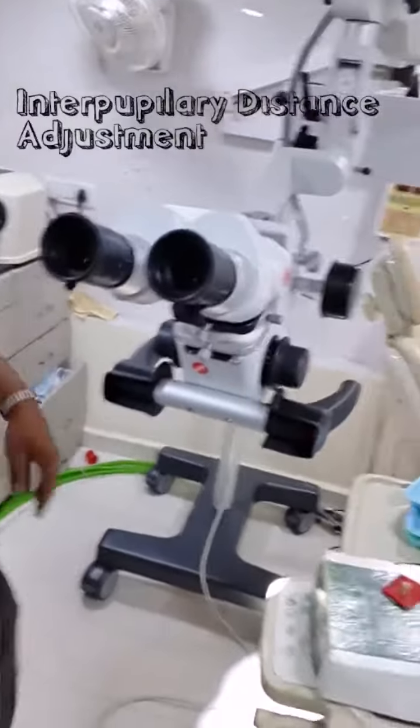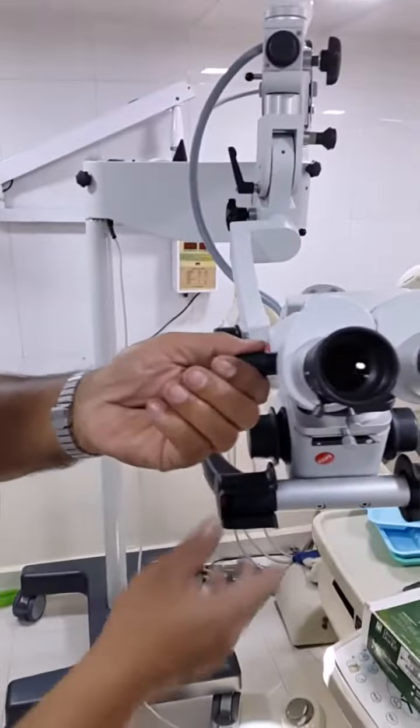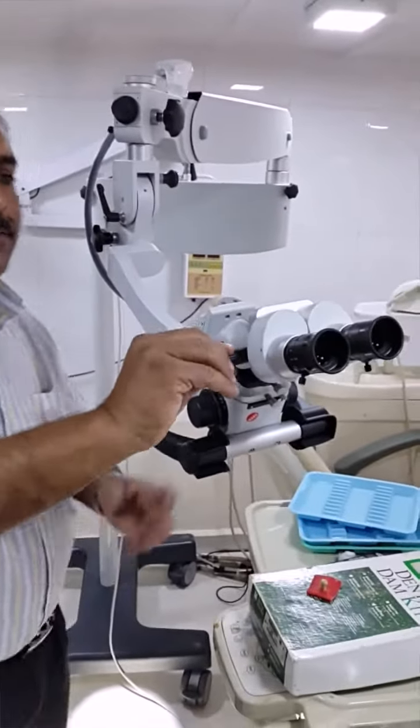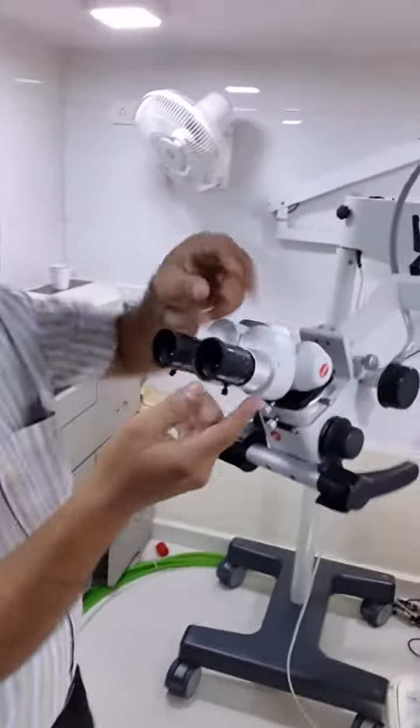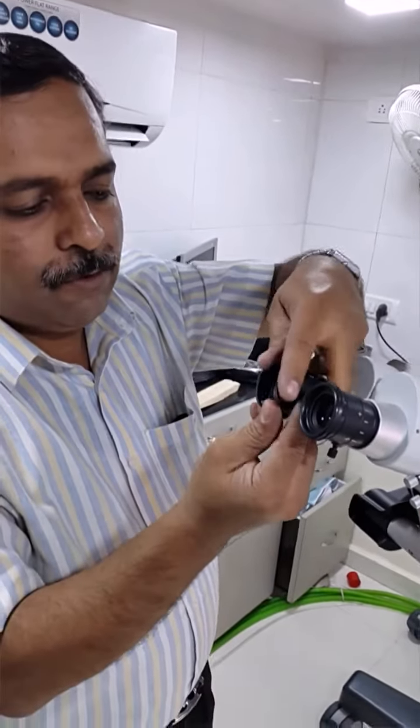Regarding the IPD — the inter-pupillary distance can be adjusted with this one-handed knob. For spectacle wearers, we can adjust the IPD in this folding position, so we can fold it here.